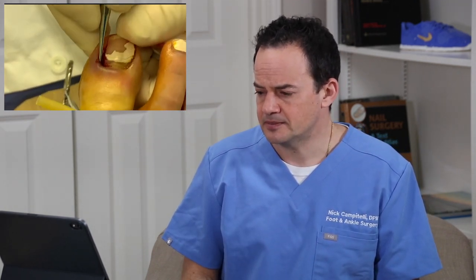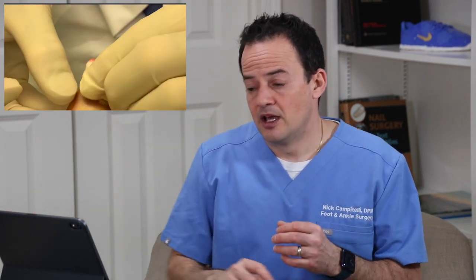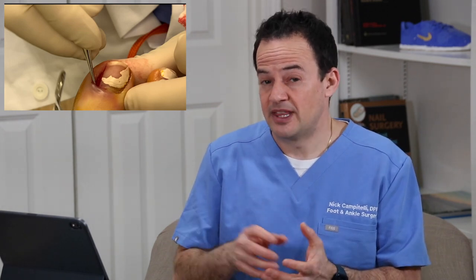I'm constantly using gauze to keep the area clean, then we remove a little redundant skin. Next, we go in with a curette to free up and check underneath the cuticle area, looking for any pus or infection and making sure the toenail is stable. If the toenail is loose and we find infection under there, that's a reason to take the entire toenail off. Also, if we're probing with the curette and encounter bone, that means there's a sinus tract infection going down to the phalanx — that could indicate osteomyelitis or a bone infection.